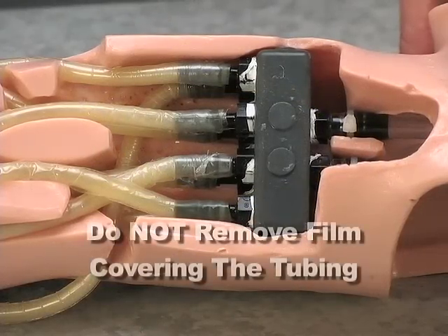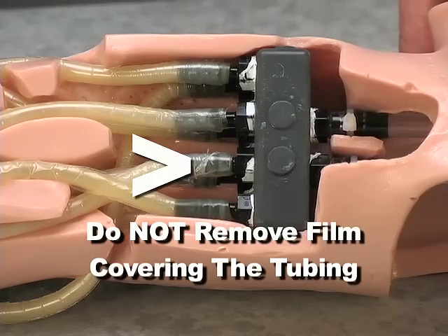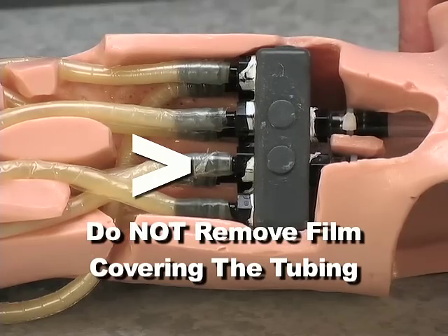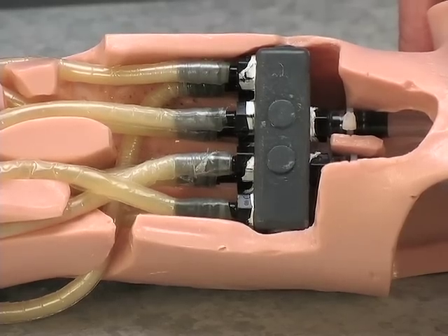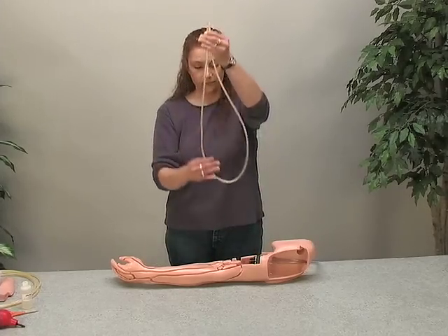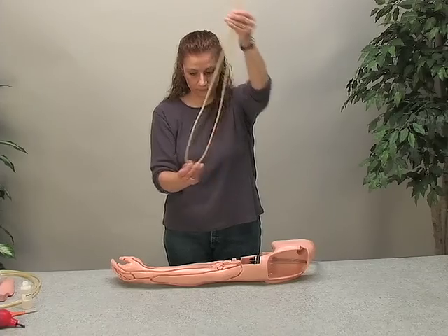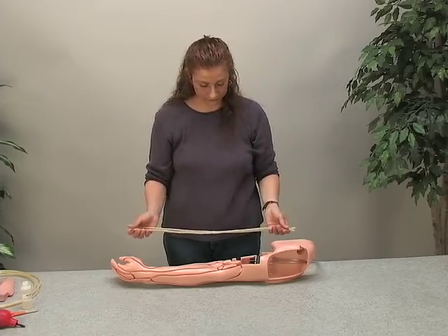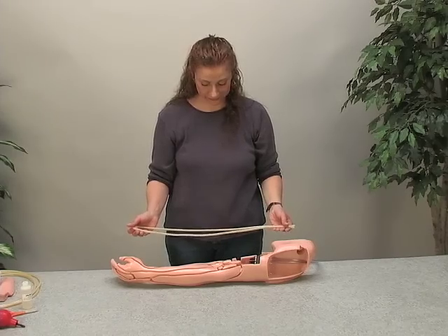Additionally, do not remove the film from the replacement tubing, as this will negatively affect the quality of the arm. These veins connect into the eight fittings on the connector block. Each vein contains a metal spring inside — check that the spring is in the middle of each vein. This will prevent the tube from pinching around the fingers.